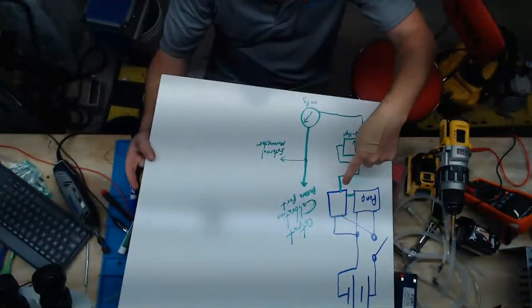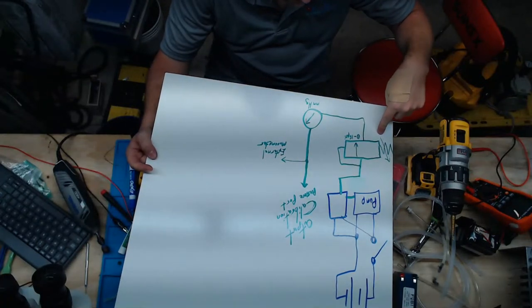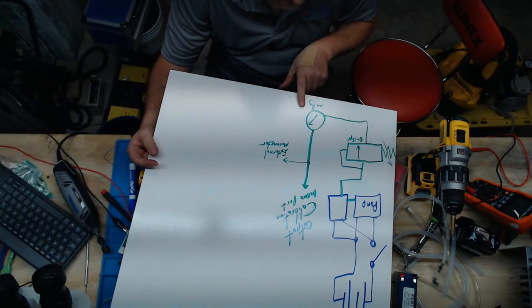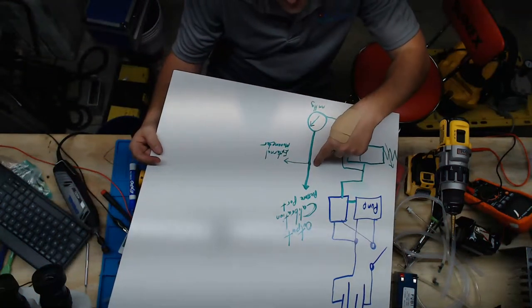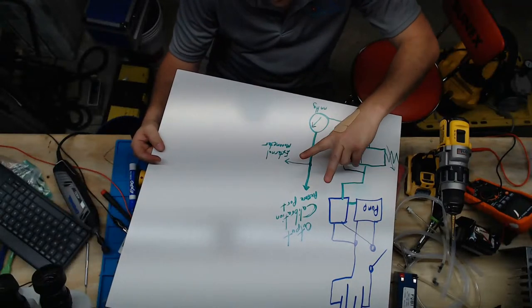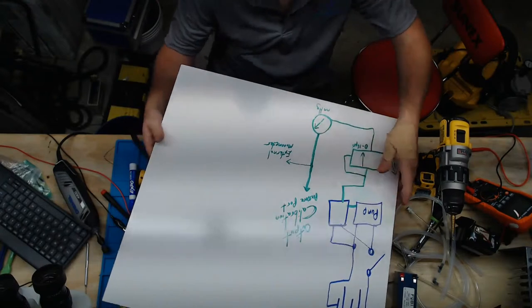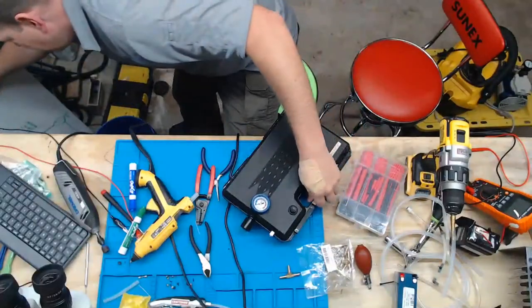So anyway, your pressure comes out of your pumps. It goes into your regulator, 0 to 15 PSI. It goes into your analog gauge. And then from there, it goes to your output port where it's going to tee off to your external manometer and your device under test. Very simple. Very, very simple, guys.